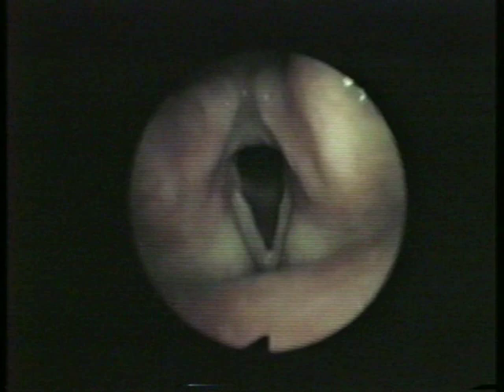Now, Pat, let's have another little warm-up. Do that again. Do that again, another warm up. Good. Okay, Pat, we want to see different types of adduction. Let's start with a tone that's too tight. E. Another tight tone. E. Good, relax. Let's have another tight adduction.